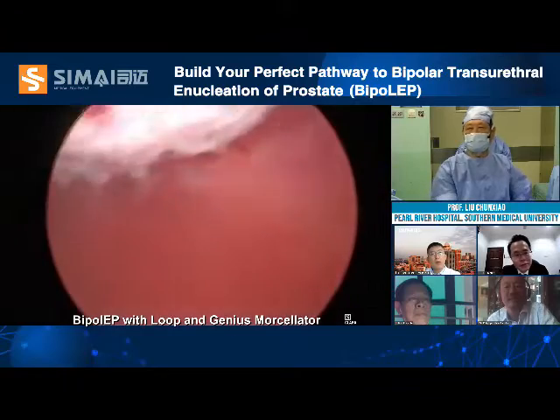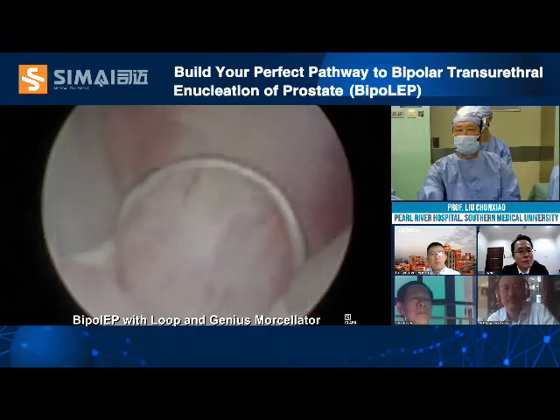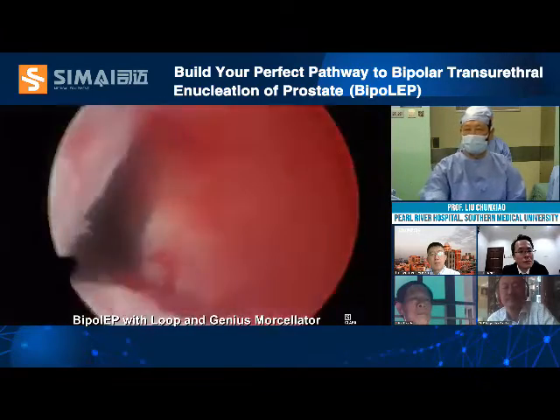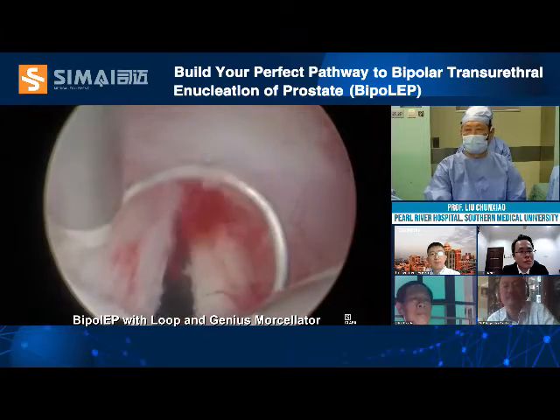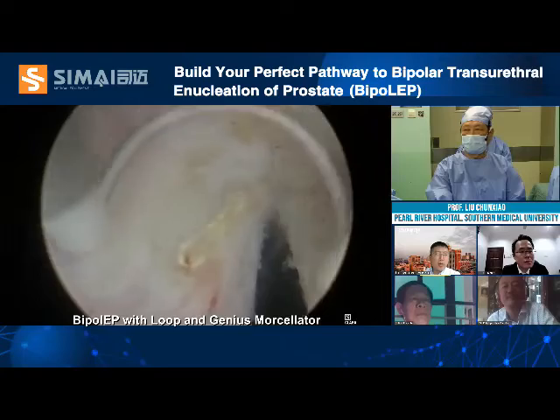So we turn to here — you can see. Just give us some little... now you can see here the preparation of the bladder. That's the 12 o'clock. Can you see? Yes, yes.